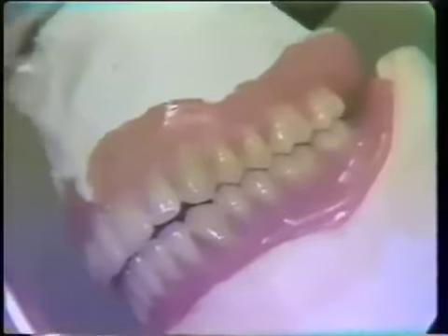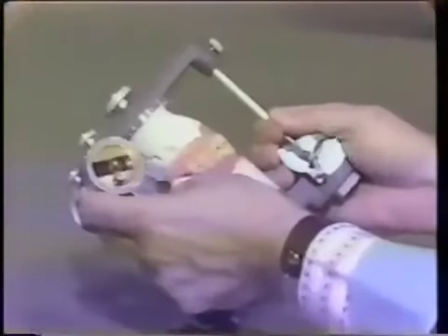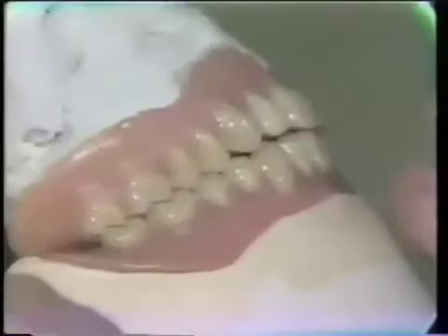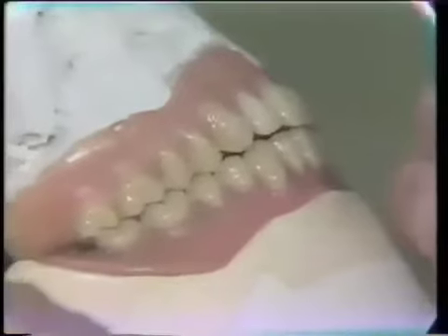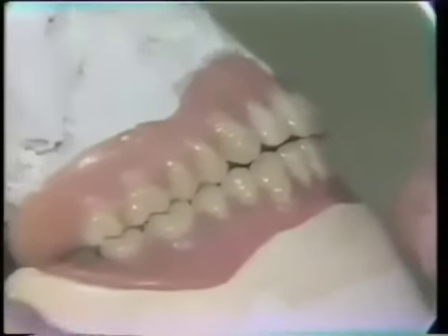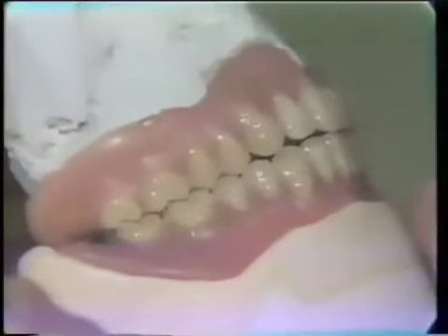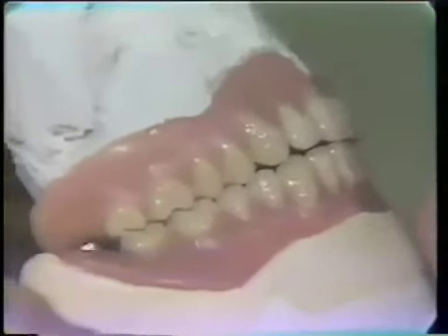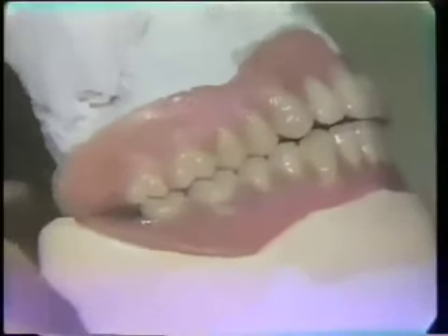These teeth balance fairly well right now, so we have minimal adjustments due on this case. Sometimes, either because of carelessness in the setting or undue processing changes, the teeth do need more adjusting. You can see some teeth going through working — for instance, the first molars do not touch as they go through, and they should. I'm probably getting an excess contact somewhere that has to be identified.